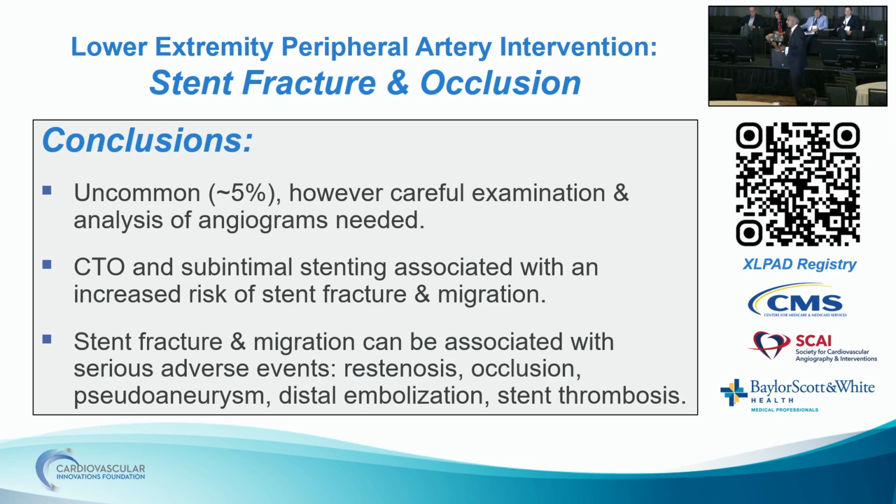However, CTOs and subintimal stentings are associated at least with increased risk of stent fracture, with this preliminary observation with stent migration. And the adverse effect of stent fracture and stent migration does not need to be repeated, and they are shown. I've provided the QR code to look at it, and of course, want to say not just thanks, but significant gratitude to the rigorous amount of work my team has done in establishing protocols to measure this, and hopefully this will set standard for adjudicating such studies in the future. So thank you. Happy to answer any questions.